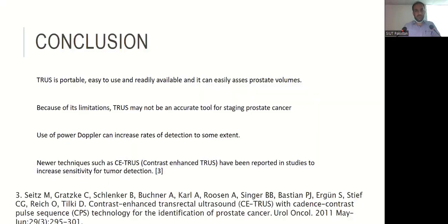Dr. Amit, can we say that TRUS is only specific to examine the hypoechoic area of the prostate, for prostatic CA or other pathologies? As Dr. Jamal has explained in this presentation, prostatic CA is not always hypoechoic.